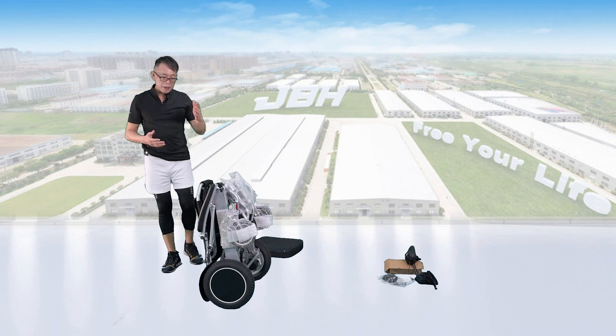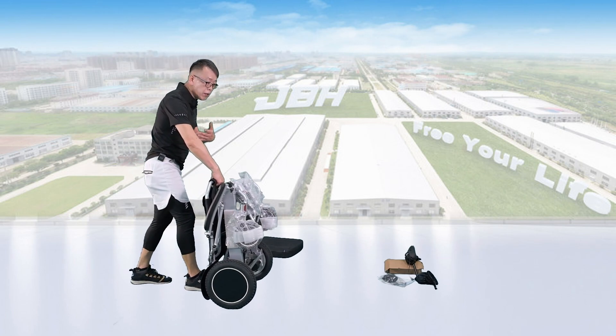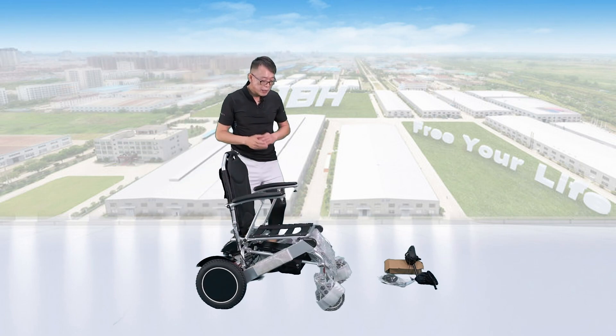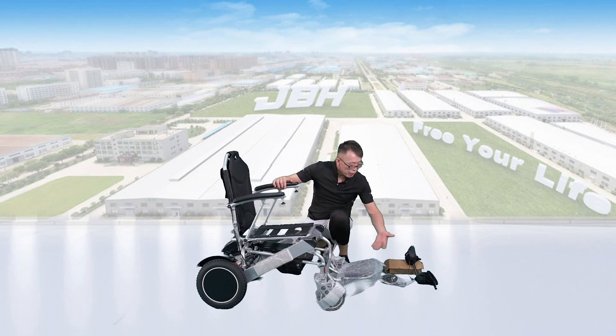First of all, let's open up the wheelchair by holding the top of the seat back and leaning towards the front a little bit — you can open it up in just one second. Right under the seat, there's a storage bag where you can find the four accessories I mentioned earlier.